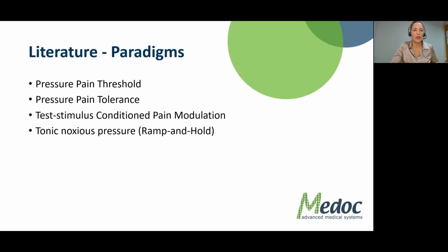with the algometer. So pressure pain threshold, as I said, is the first moment that the pressure is becoming even the slightest painful. And that's the moment the patient is pressing the button. And this is, of course, a limits test, that you may know from thermal testing as well. Pressure pain tolerance is the moment that the patient can no longer withstand the stimulus. And that's the moment that you want to stop applying the pressure.